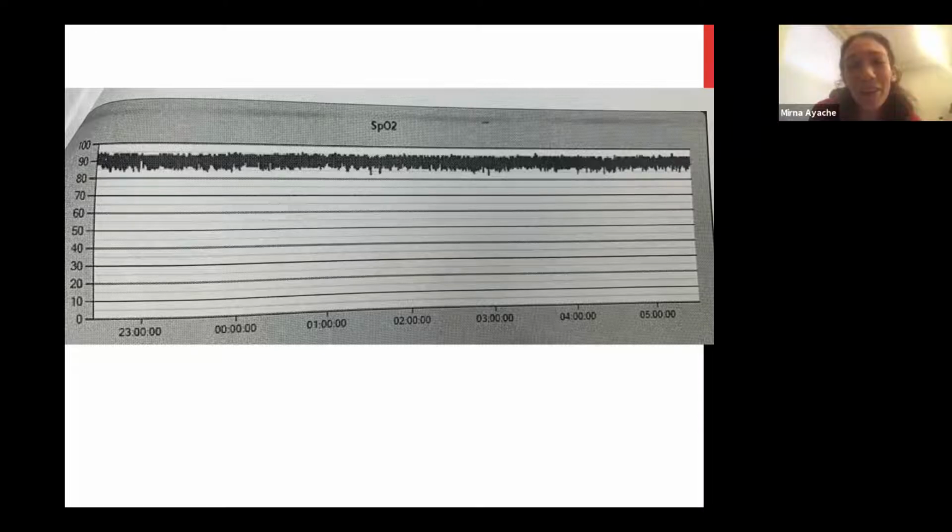Yeah, so you guys are absolutely right. This was actually an inpatient overnight pulse oximetry at Metro Health, and the patient had a cardiac arrest, and he was pretty much comatose post arrest, and he had abnormal breathing. And they got this overnight pulse oximetry. It's very, very uniform. You can see the drops go down and up to exactly the same level. Perhaps they're sleeping or maybe not. We don't know. The patient actually doesn't have a normal mental status to know.